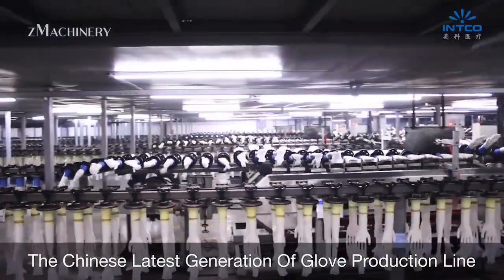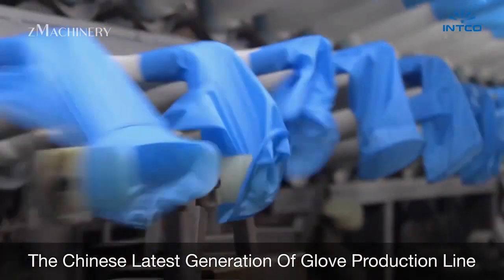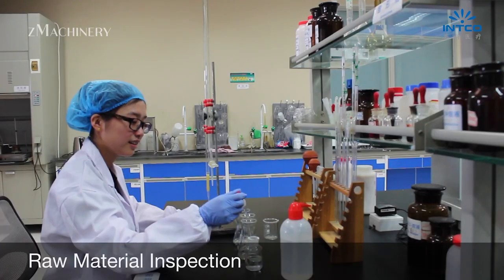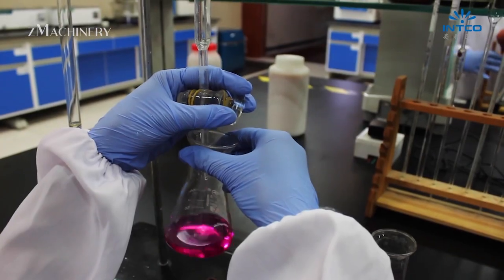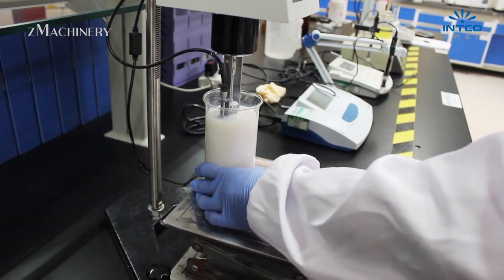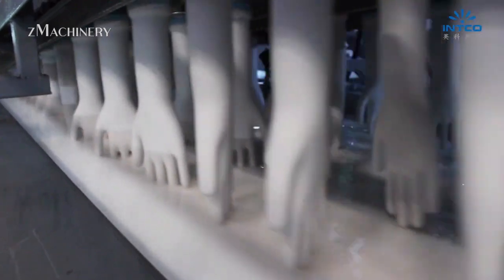INCO Medical is a leading manufacturer of disposable gloves in China, specializing in nitrile and latex products for medical, industrial, and general use. Production begins with the preparation of high-grade raw materials blended into a stable compound. This glove solution is stored in large tanks and kept at controlled temperatures to ensure quality and consistency.